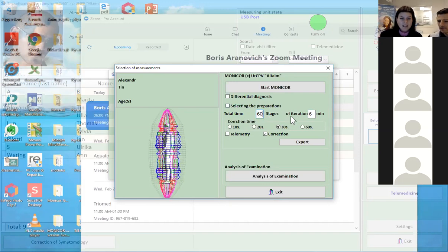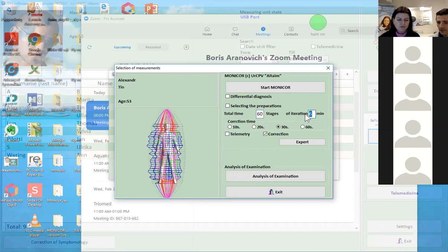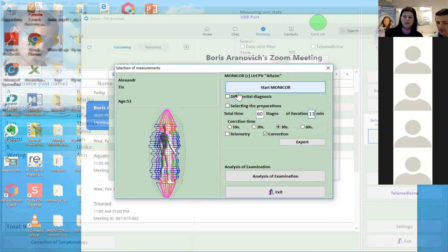What does it mean, the stages of iteration? It's like the device is measuring you all the time. So if you do an hour of treatment, you can do it like every 10 or 13 minutes, it will measure you. So it will do 5 measurements during this treatment. Okay, and where will that come up on the system then?